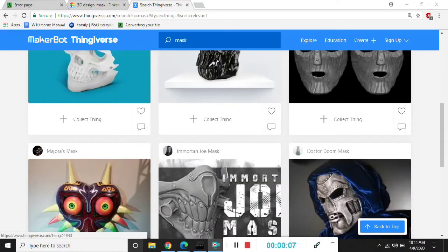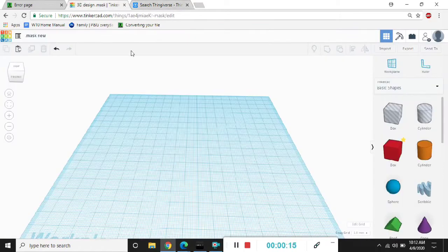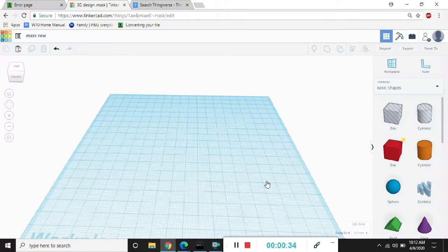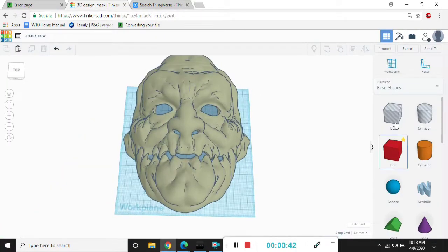What's up YouTube? Thank you for viewing my first of many new videos. I'm gonna show you how to make this COVID-19 face mask. First, I downloaded a mask from Thingiverse and I also downloaded an N95 mask.